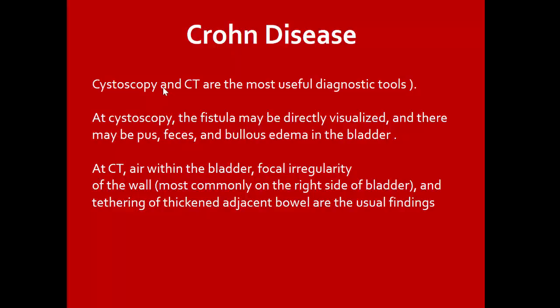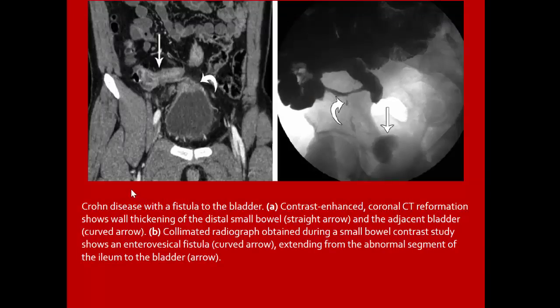Crohn's disease is one cause of cystitis. CT is the most useful diagnostic tool. Cystography may show fistula directly visualized. There may be feces, pus, or polypoid edema in the bladder. CT shows air within the bladder, focal irregularity of the wall, most commonly on the right side of the bladder, and thickening of adjacent bowel. Case of Crohn's with cystitis and fistula to the bladder: contrast-enhanced coronal CT shows wall thickening of distal small bowel adjacent to the bladder. Small bowel contrast study shows enterovesical fistula extending from abnormal ileum segment to the bladder.